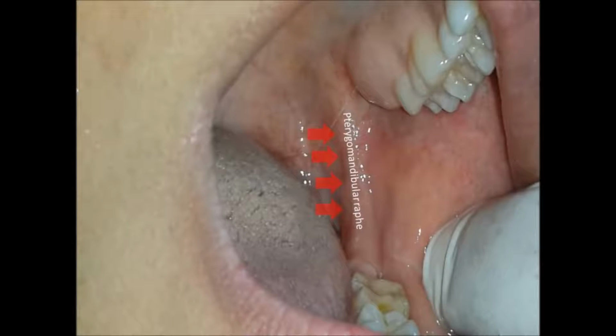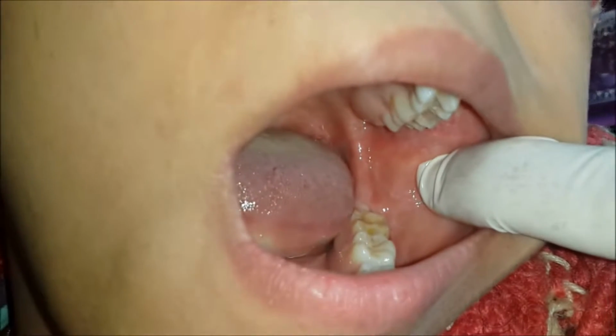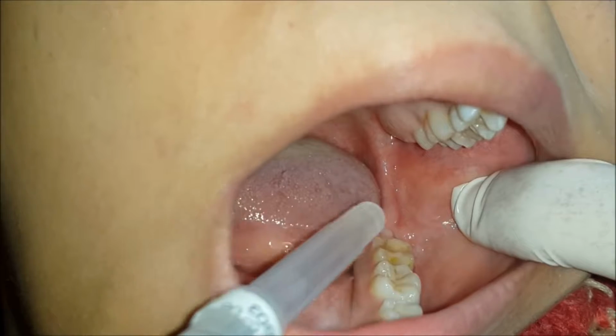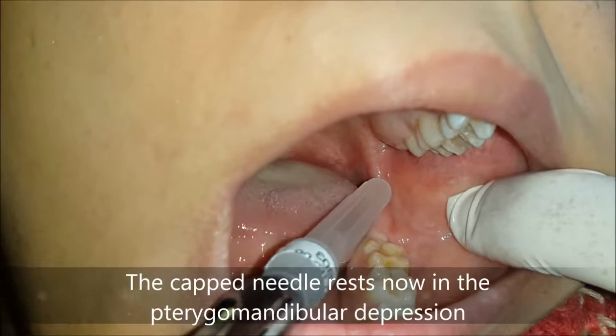The next step is to identify a soft tissue roll in the oral cavity called the pterygomandibular raphe, denoted by the red arrows. The identification of this raphe is critical for the success of this block procedure. Just lateral to the pterygomandibular raphe, there is a depression called the pterygomandibular depression. Right now, the capped needle is placed into this pterygomandibular depression so that you can identify it clearly.